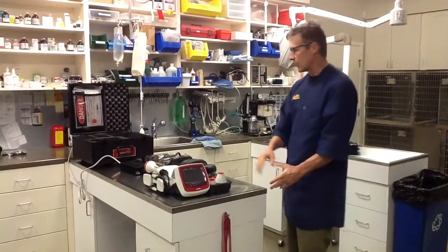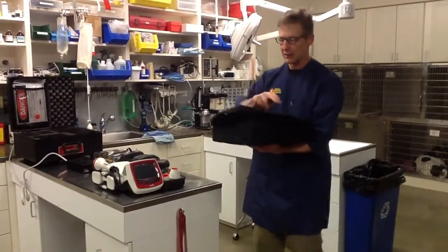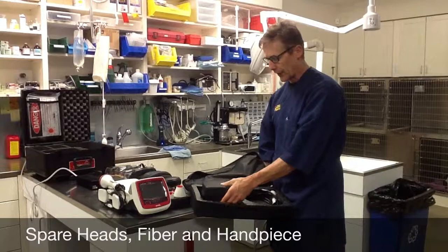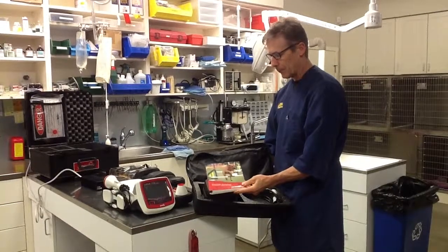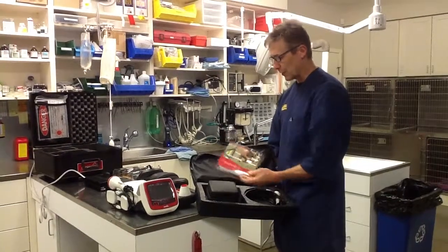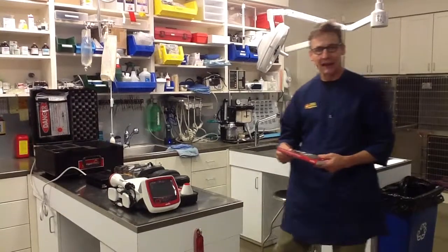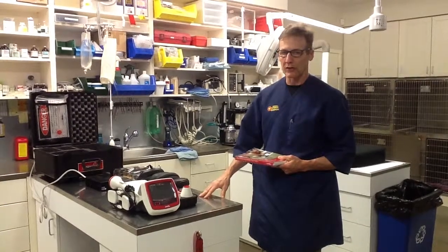So the first thing I want to talk about are the different components. You're going to have a soft package that arrives that looks like this. When you open it, you'll probably have a pair of glasses in here. I store the extra fiber and handpiece in here, and an extra set of the foreheads. On the top of this envelope you'll find one of the books, the Laser Therapy in Companion Animal Practice. Sometimes people have a hard time finding this, but that's usually up in that top envelope. These are basically backups, spares — put this in a safe place. You should not need to access it again unless you have a problem with your fiber handpiece or different heads.